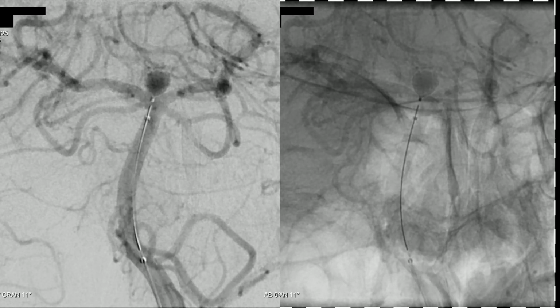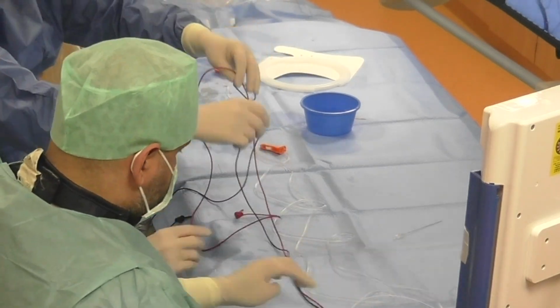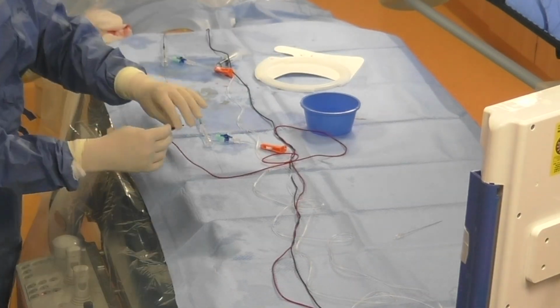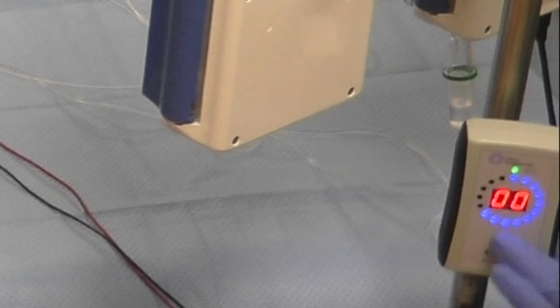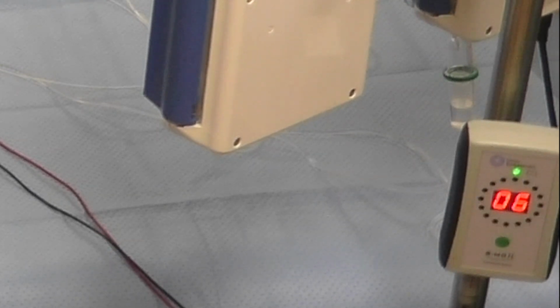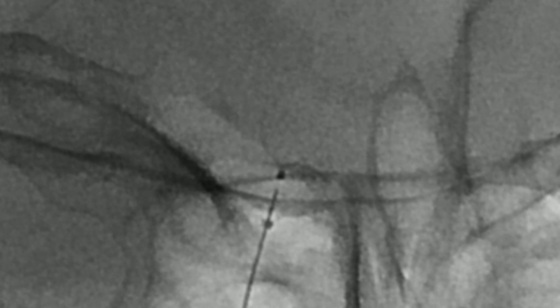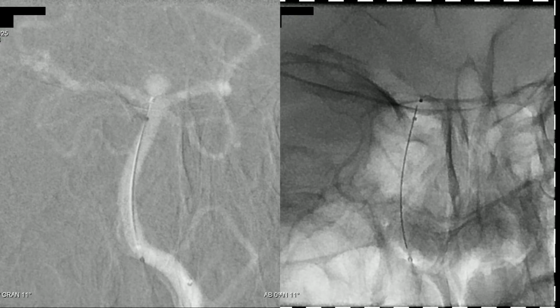And as you can see, it doesn't prolapse in the lumen of the vessels, and thus we can detach the contour device. The black cable would be connected to the body of the patient with a needle, and the red cable to the pusher of the contour device. And now we press the button on the detachment device. It needs some seconds, and we continue fluoroscoping to see the detachment. And here we see the pusher jumps a little bit back, confirming the detachment.